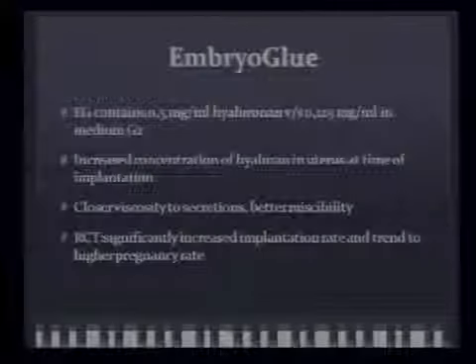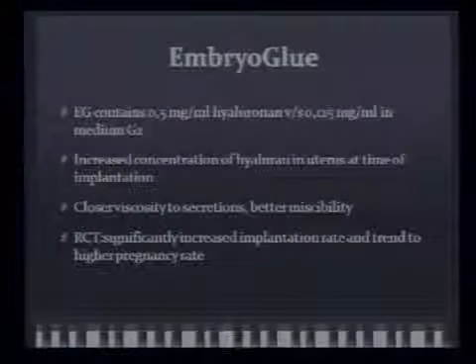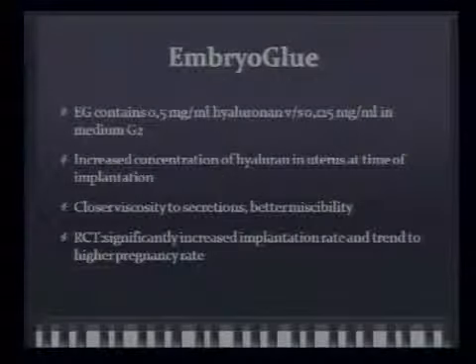These are the types of embryo catheters, soft versus firm catheters, that were used in the previous studies. And when we look at the two meta-analyses, by Buckett and Abou-Setta, we know that the soft catheter is more successful in embryo transfer, and it should be preferred compared to the firm catheters. And another approach is embryo glue.